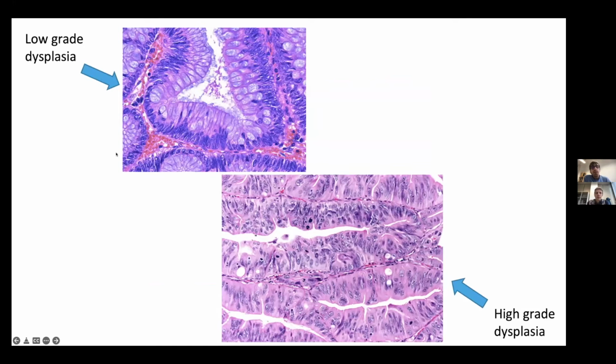And then you cannot say just presence of dysplasia. You have to stratify it to be effective in your diagnosis and also to give an effective tool to the pathologist. And this is the example of the stratification of dysplasia. Here you see a low grade, here you see a high grade. So for this kind of problem, we focus on a quite high magnification of the image because you have to recognize these nuclei, you have to recognize how atypical they are to distinguish between this situation and this situation. But it is not sufficient for your diagnosis.